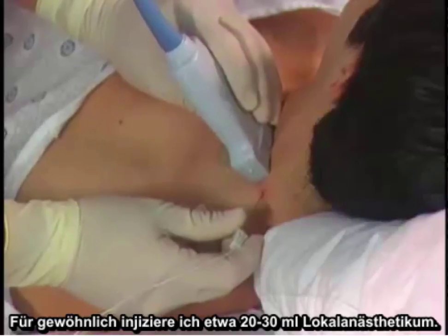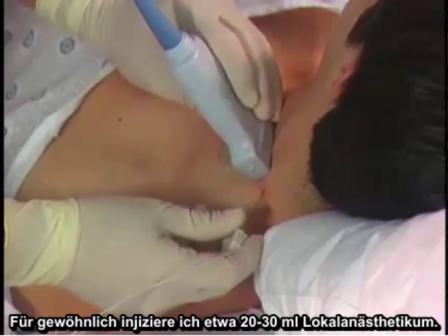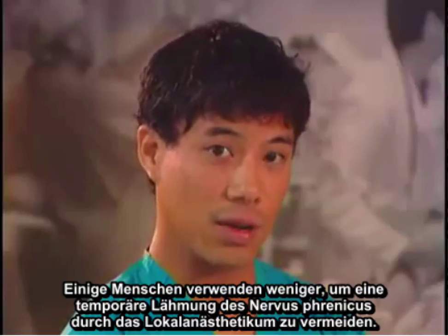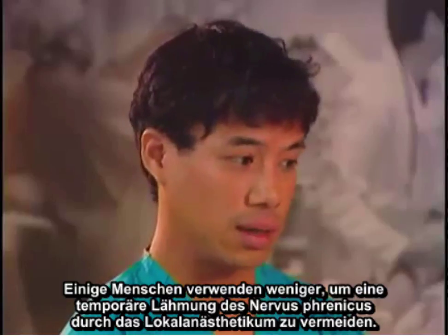I usually deposit about 20 to 30 milliliters of local anesthetic. Some people use less to avoid temporary paralysis of the phrenic nerve from the local anesthetic.